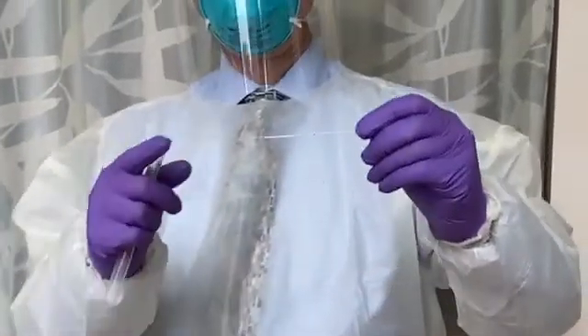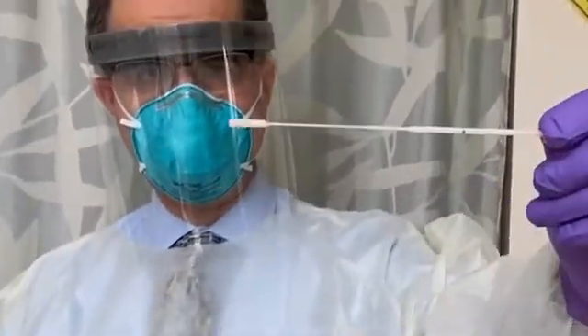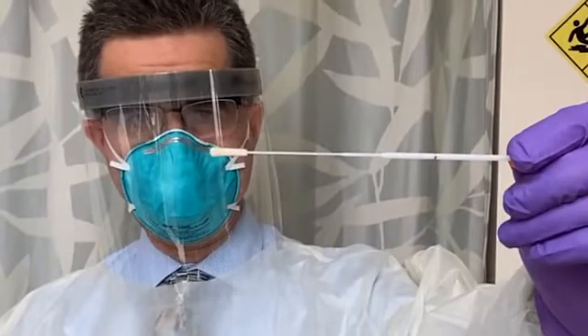Nasopharyngeal swabs are specifically manufactured to have long, flexible shafts made of plastic or metal, and tips made of dacron, rayon, or flocked nylon.